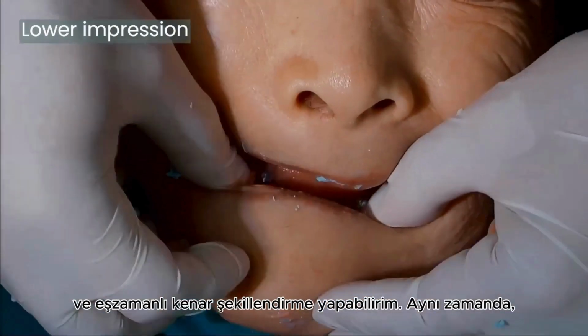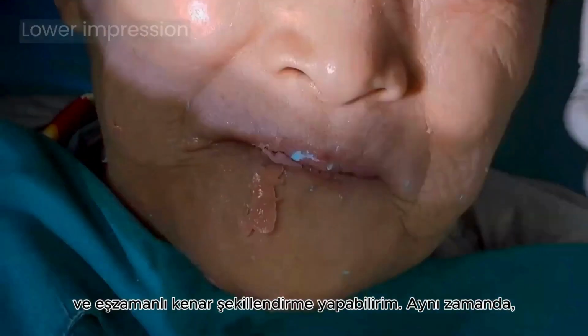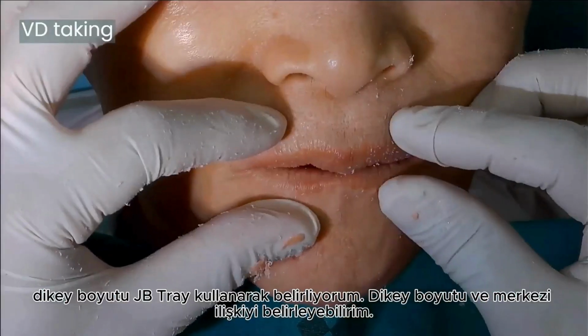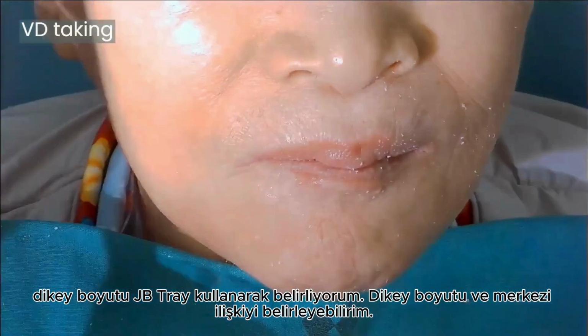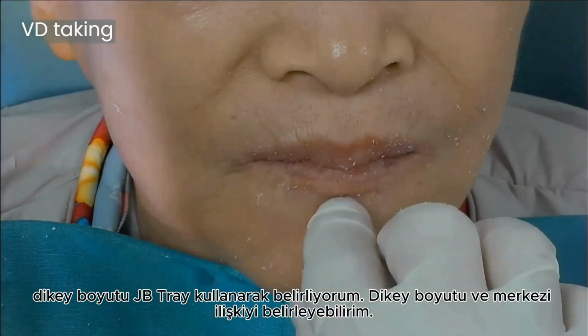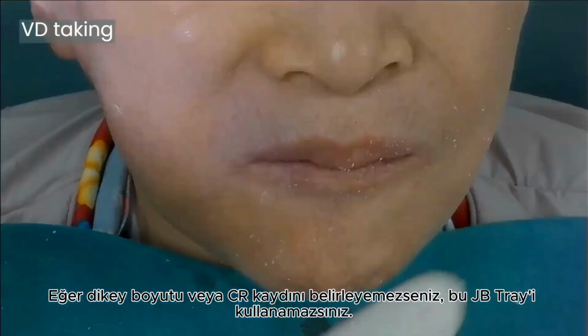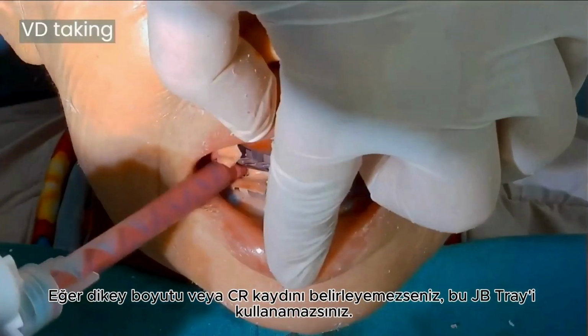With simultaneous border molding, at the same time I decide the vertical dimension using the JB tray. I can decide vertical dimension and centric relation. So if you cannot decide vertical dimension or CR recording, you cannot use this JB tray.